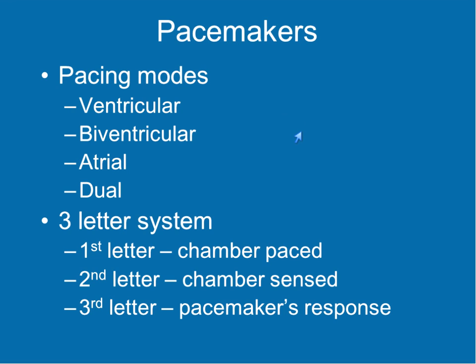Okay, the impulse that was triggered by that pacemaker in the atria, the pacer wire in the atria, is now at the level of the AV node, and now the ventricular wire is sensing, and it's paying attention. Is an impulse coming? Yes? Well, then it inhibits electrical activity. But if it doesn't come through the AV node, then the ventricular wire will initiate an impulse to allow the ventricles to be paced.